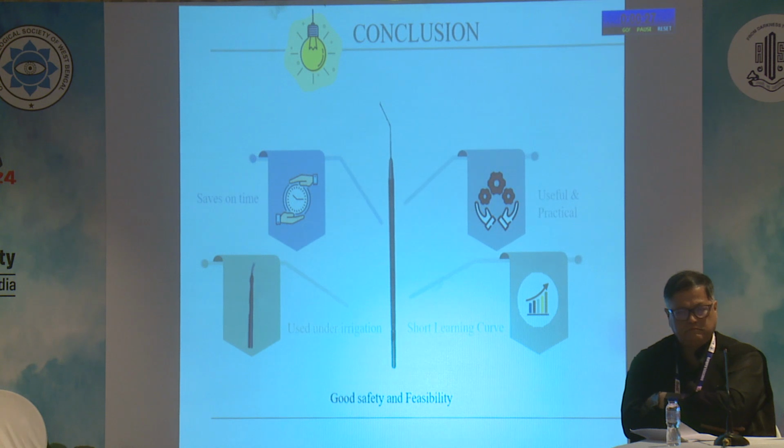This instrument saves on time. It can be used under irrigation. You don't need viscoelastic substance. It is a useful and a practical instrument with a very short learning curve, and it has a good safety and feasibility in various hands what we have studied.